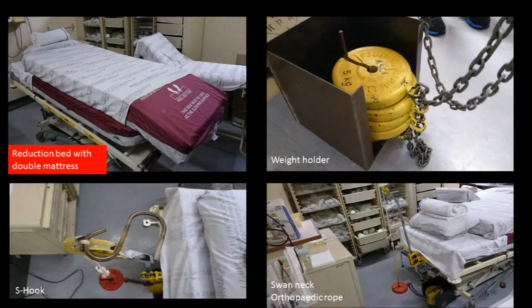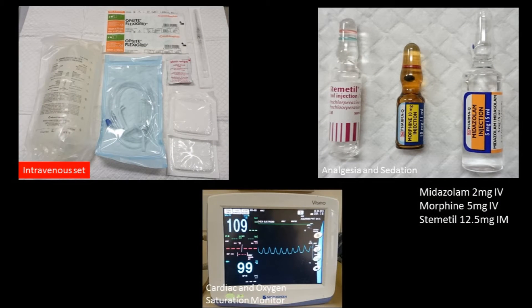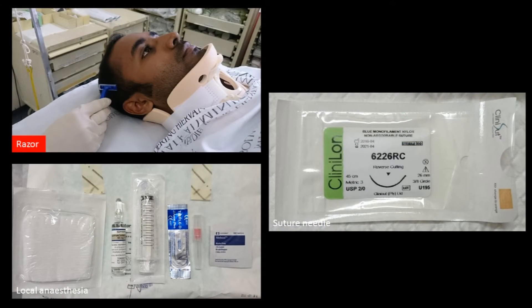The equipment required includes a bed with double mattress, weight holder, S-hook, swan neck, and orthopedic rope, as well as an intravenous set, analgesia and sedation, cardiac and oxygen saturation monitor, a razor, local anesthesia, and suture material in case of temporal artery injury.